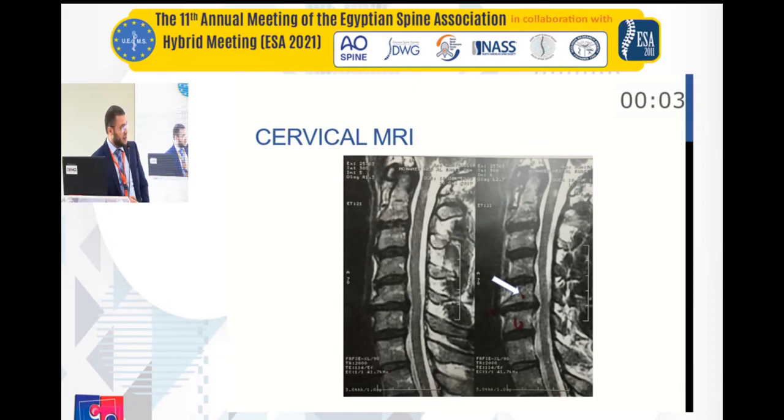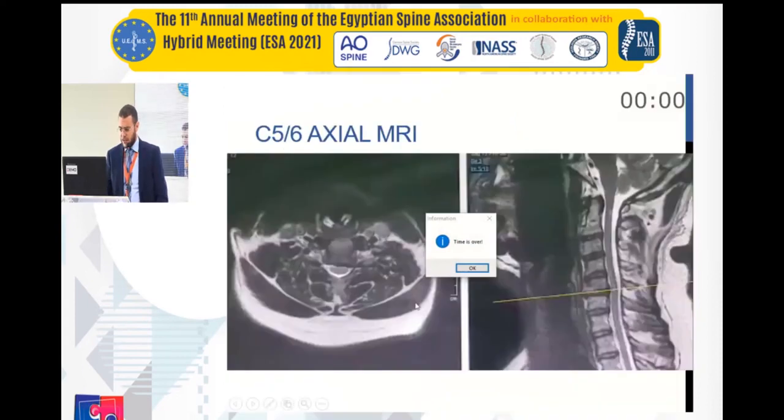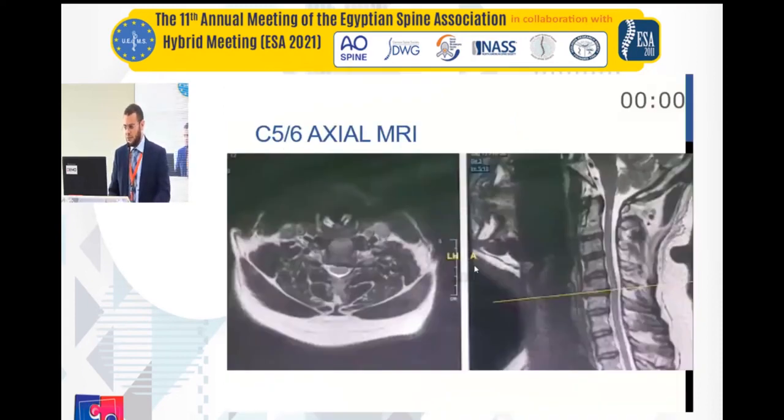This patient was screened for MS and neurodegenerative disorders, and all of them were negative. Then we did somatosensory evoked potentials on him. It was positive.